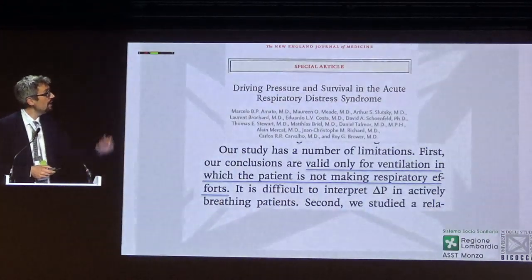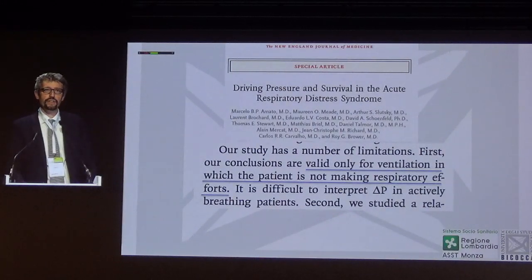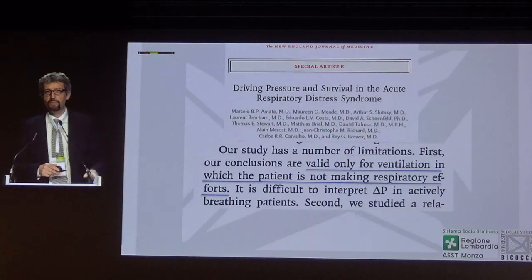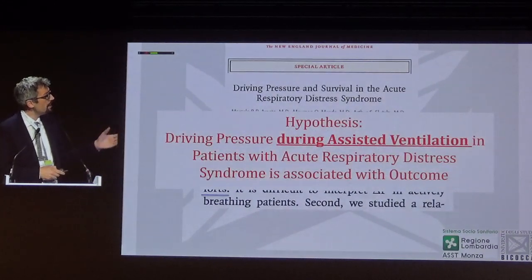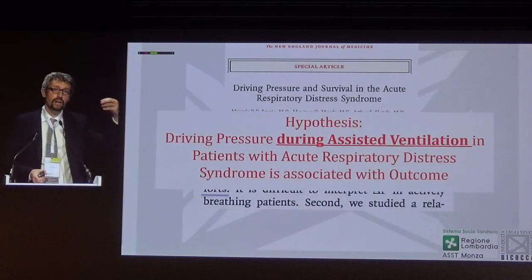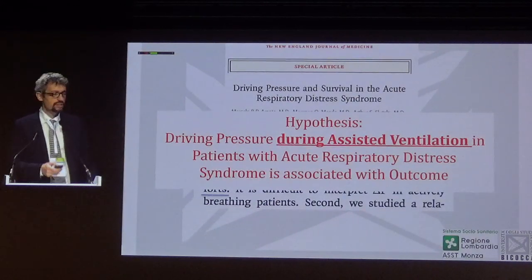And now, of course, Marcelo has told us the importance of this parameter, and in his paper one of the statements says that this is valid only for ventilation in which the patient is not making any effort. And so our hypothesis is that indeed, if we measure driving pressure the way I've shown you, also during assisted ventilation, it will have the same value as during controlled ventilation, and so it must have the same relationship with outcome that driving pressure does have during controlled ventilation.